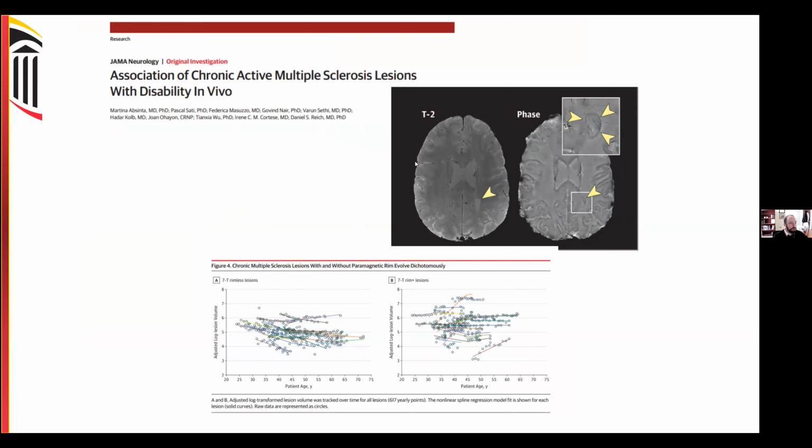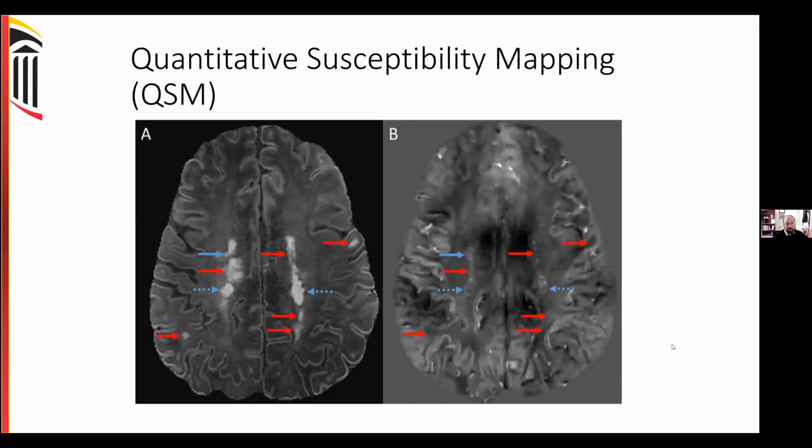And they also took a look at relating to two disability scores and found significant relationships with the level of disability.